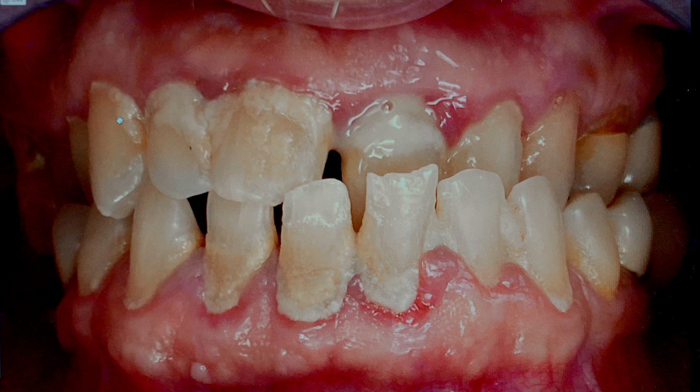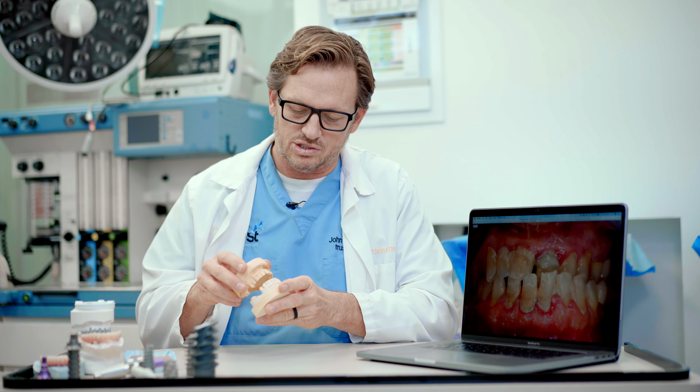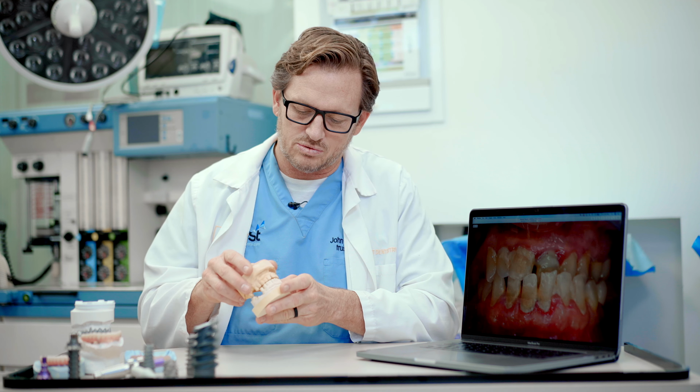So the first thing that we'll do is take molds or impressions of his mouth. We do a diagnostic wax up. So you'll notice here we've got some broken teeth, missing teeth, rotated teeth, the bite, the class 3 occlusion. We have to correct all that. So we want to mount it up on our articulator and determine, okay, where are we headed with this situation?